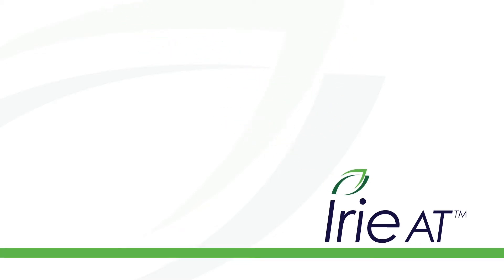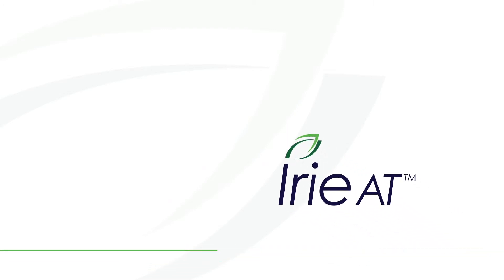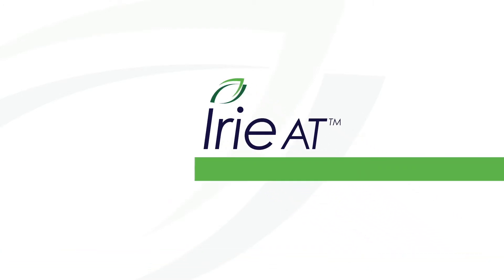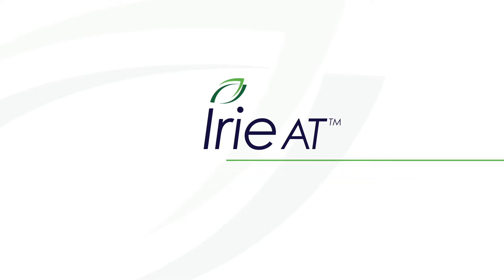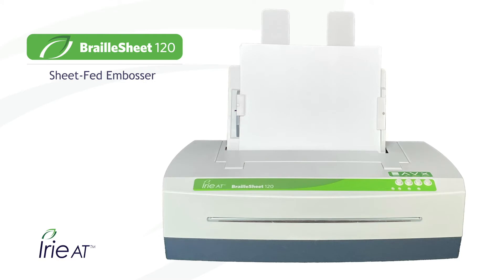Welcome to the Irie AT Product Review Center — Irie AT, where you'll always find the best in Braille and low vision products. Today's focus is the Braille Sheet 120 Sheet-Fed Braille Embosser.